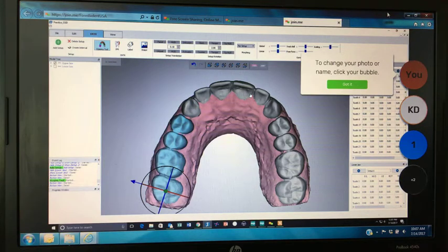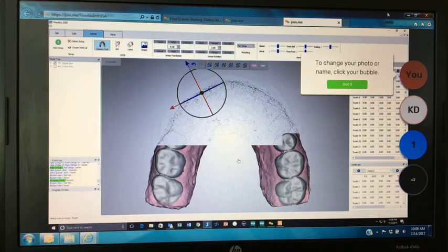Okay, so now you're going to move all these teeth where you want this patient to finish. So you're moving it to the ideal position. Now, I'm not the treatment planner here, so I do the data processing only. So you might be a little horrified with how I move these teeth. So don't be worried because I would not be the one treating your cases. And it's probably left best in the hands of doctors. I just want to get some movement here so I can show you a little bit more about the software and the options that you have.